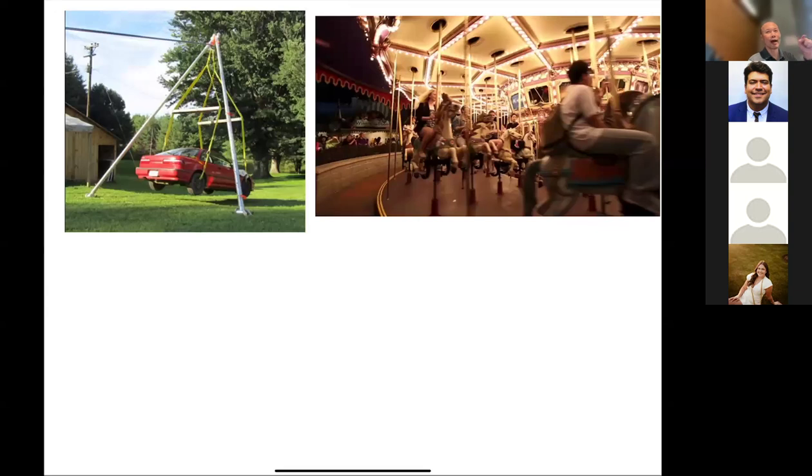Yeah. So you have to hit it at the resonant frequency, right? Because if you hit it at the wrong time, you're going to break your finger, right? Okay. So that's the idea. You have a very weak field. This is a lot of weight, right? That's the weight of this car, which is a very strong force going this way. And you're trying to oppose that force with something that's very weak. So the only chance you have is to hit it at the resonant frequency. And each time you hit it, you perturb it a little bit. That's what the B1 field is doing.